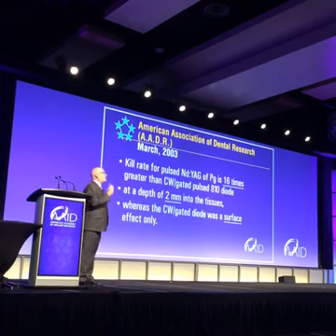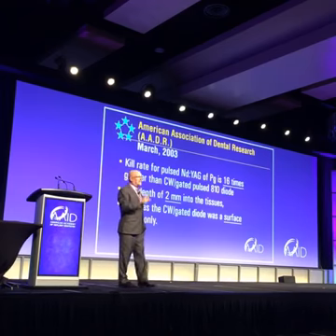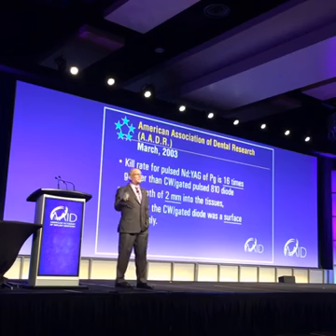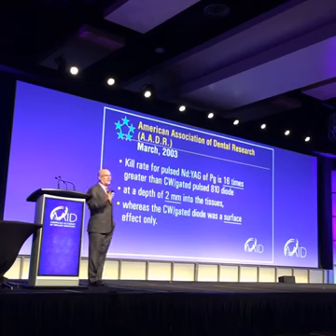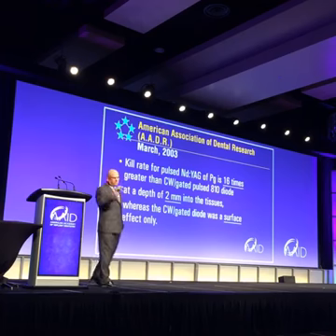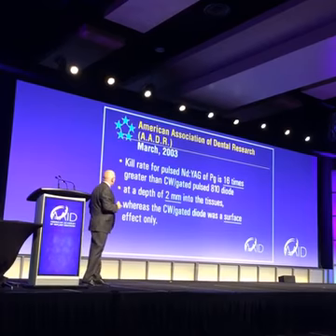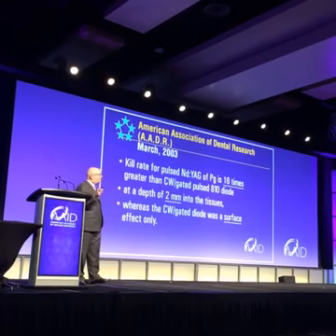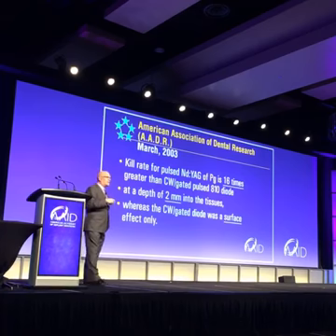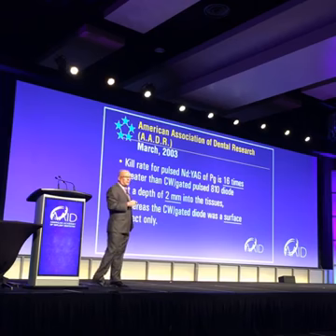And the other thing I'm going to tell you is if you buy a diode, a diode is a diode is a diode. I don't care if it's 810, 980, 1064, it's still a diode. It's basically electrosurge with light. That's all it is. It's a hot tip. So base it on price. Don't base it on really anything else. Maybe the cool factor if it's a small little diode. But the point is that the Nd:YAG reached 2 millimeters into the tissue, whereas the diode was just surface. So you're getting bacteria kill past the point of contact. That's important.